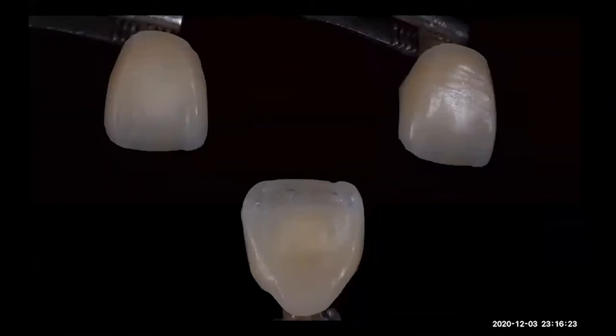We did the external stain, following some characteristics of the restoration. And then once the glaze is finished, we need to follow it. For example, if you put blue in the concavity in the distal and mesial, and a little bit of chroma in the mamelons in the middle of the tooth, the idea is to try to follow the same color with the ceramic.